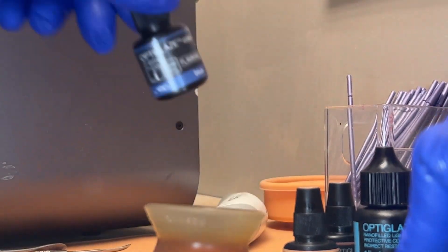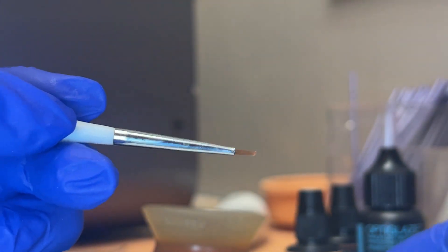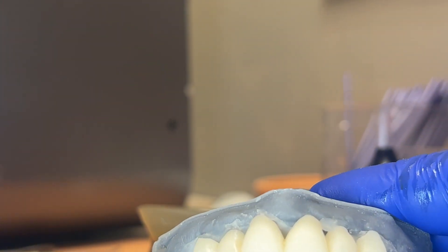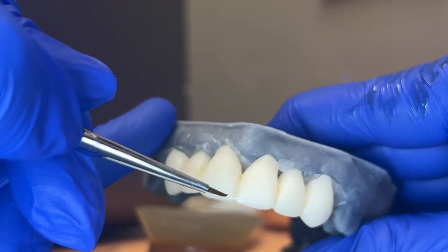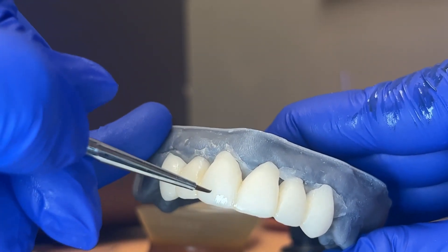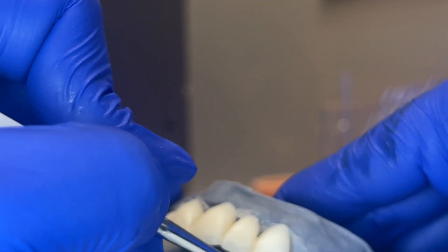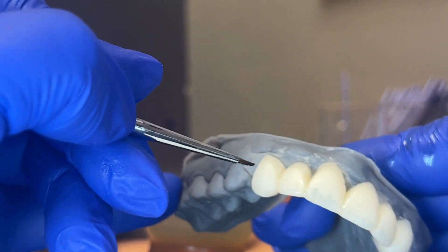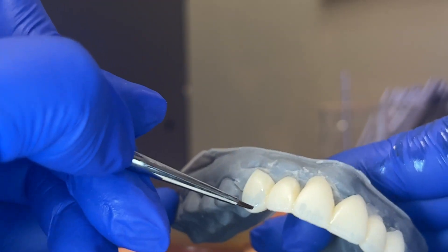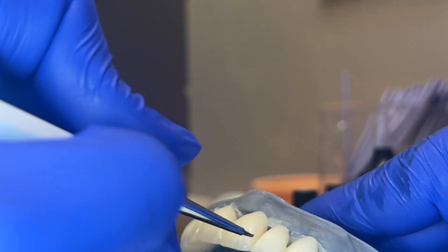Then I'm going to move to some blue on the incisal edges — this is where I use my thinnest brush. You can always go extra. I like to do gray on the incisal edges but then blue on the vertical embrasure areas. Everyone's different — do what you like, do what works for you.